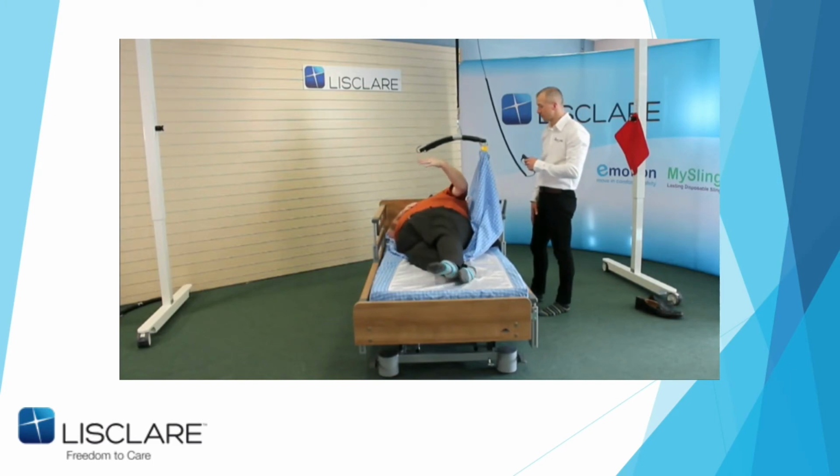Now, normally that would be on a 4-foot bed, so you'd have more room. But it's a good demonstration to show you because I am actually within the weight capacity of this bed. So it should work for me. But again, the ergonomics would be a bit different. So again, there's a quick demonstration of a positive active patient, a negative active patient, and then a passive patient that's bariatric or plus size, whatever you want to prefer.